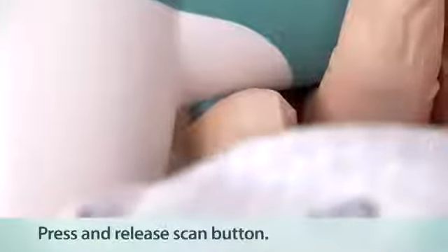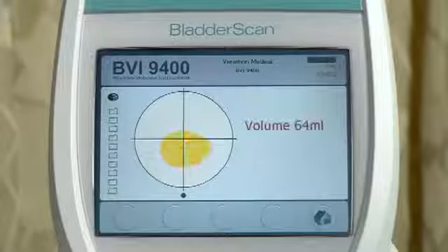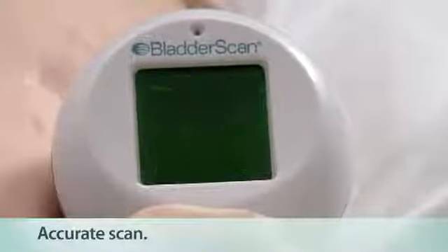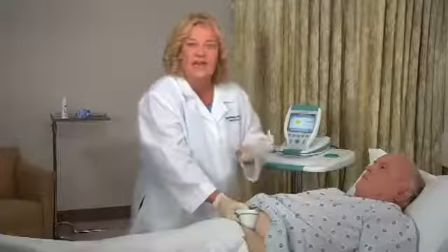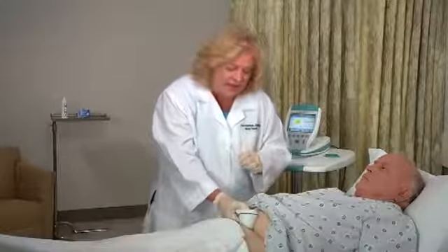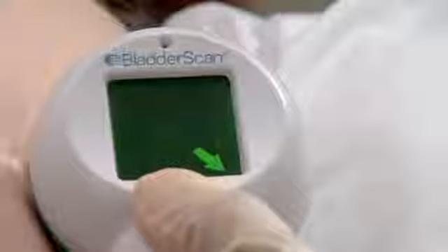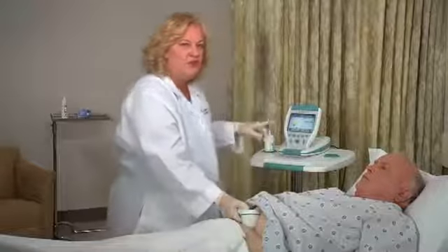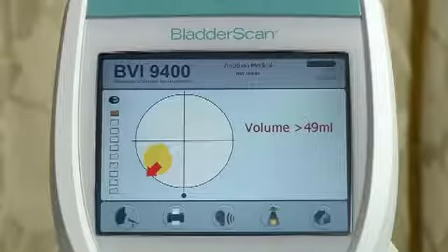Press and release the scan button located on the underside of the probe. When you hear a beep, the scan is complete and the bladder volume measurement is displayed on the console. You know the aim is accurate when all eight arrows are flashing on the probe and the bladder image is centered in the crosshairs of the console's aiming icon. If the scan is off target, the arrows on the probe indicate the direction of the bladder. A solid arrow means you are slightly off target; a flashing arrow means you are significantly off target. The console will confirm the bladder is off target and an arrow will point in the direction of the bladder.